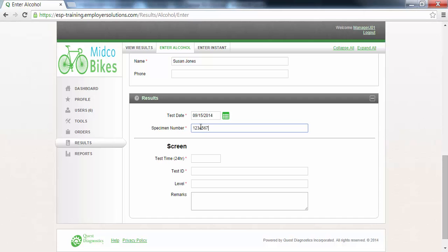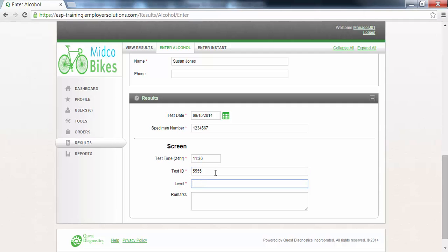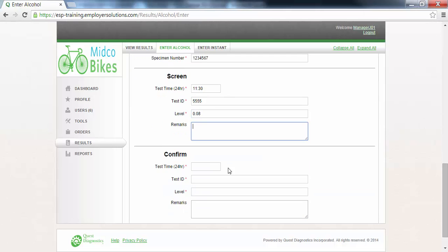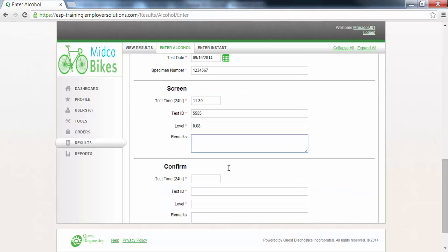In the screen section the test time, test ID, and level detail from the testing device is recorded. Any remarks concerning this test can be entered in the remarks box. If the level of the screen exceeds the threshold established by your organization or exceeds the default threshold of 0.02%, a confirm section will be displayed where the confirmation test results can be recorded. In this example we will enter 0.00 for the screen value.